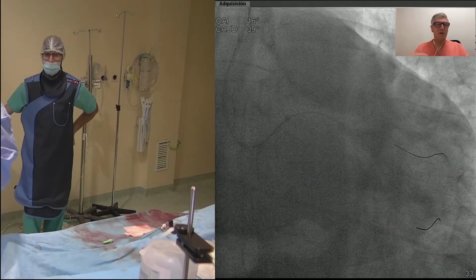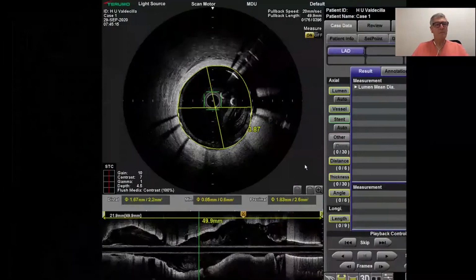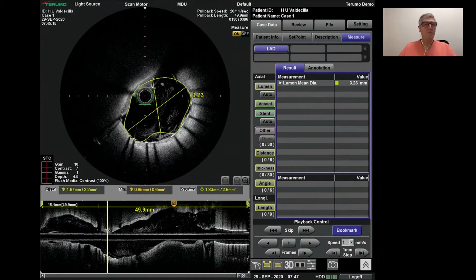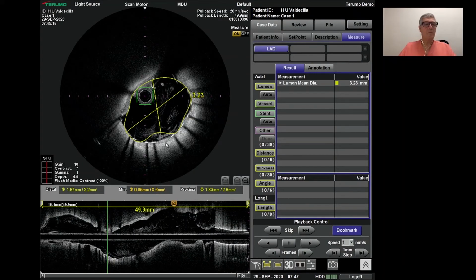Show again distal please, proximal part, bifurcation. We're going to show the most important, the critical, where we can see, look at, where's the minimal area there? There, that's that point, 8.6, which is excellent minimum stent area for a circumflex, which is really good, even will be good for many mains. Yeah, 8.6 is excellent.